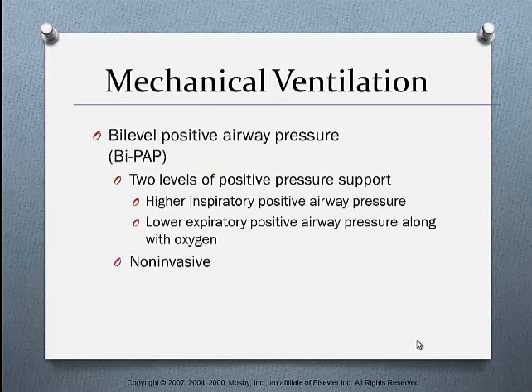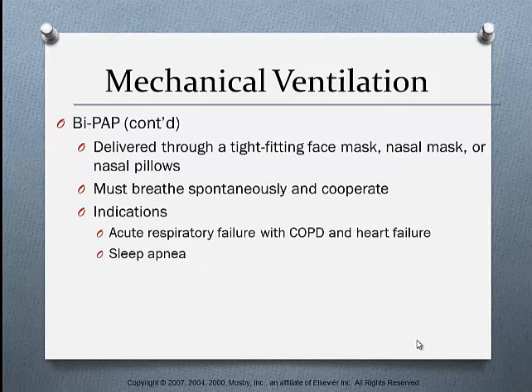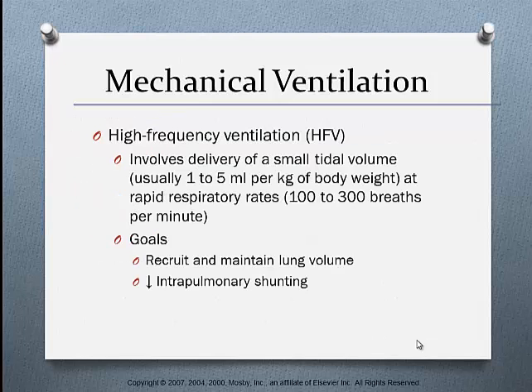BiPAP: there are 2 levels of positive pressure support, a high inspiratory positive airway pressure and a lower expiratory positive airway pressure, along with oxygen. It is non-invasive. BiPAP is delivered through a tight-fitting mask, a nasal mask, or a nasal pillow. Patients must breathe spontaneously and cooperate. It's indicated for acute respiratory failure with COPD and heart failure, and for sleep apnea.